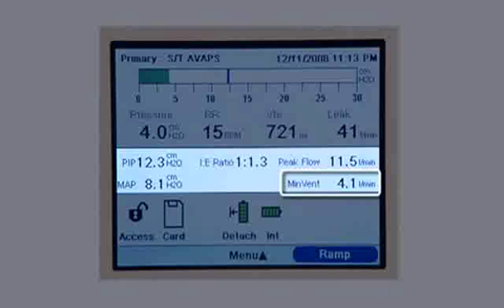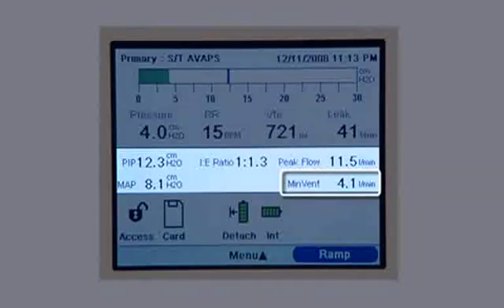Below that, minute ventilation, shortened to MinVent, displays the amount of air delivered to the patient over the last minute. Now let's move on to the status panel at the bottom of the screen. Various symbols appear here to show what features are activated.